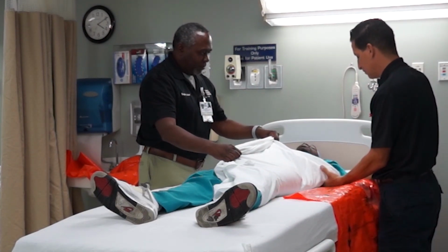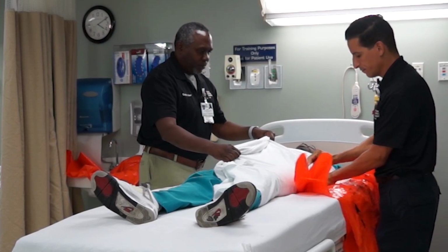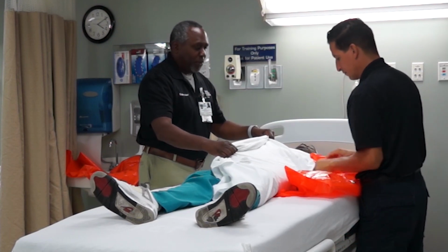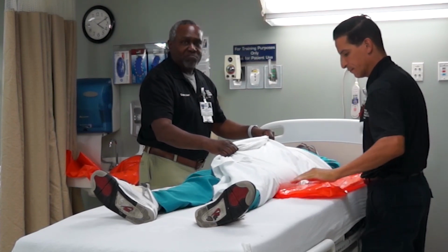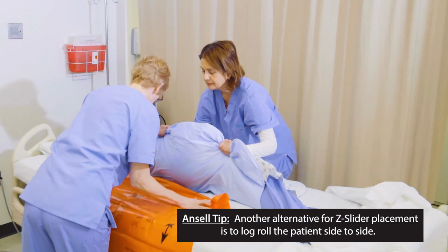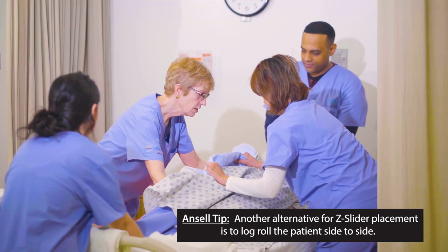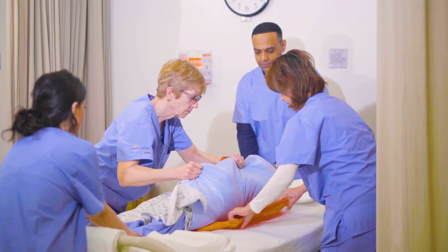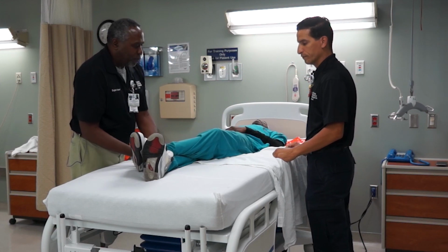I'm going to take the Z slider and place it underneath the patient. If you push down and under, they slide under the patient pretty simply. You're not looking to get it completely under the patient, just a good amount. Another alternative for Z slider placement is to log roll the patient side to side. Going to cross the patient's legs in the direction of rotation.